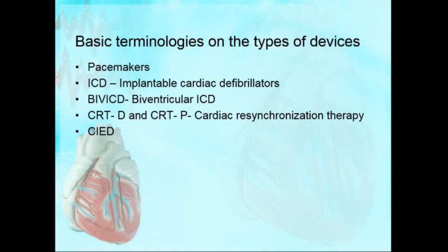Why should you know this? If you are taking care of a lot of transfer patients, many big institutions have moved on to this terminology. They don't use BiV. So where I was in EP fellowship, the Mayo Clinic Jacksonville, all the dictation notes would always say, patient has this, will qualify for CRTD. And if you've never heard of CRTD, you don't want to be caught off guard, this is CRT. So if you look at your MKSAP also, they moved on to use this terminology. And that is the accepted terminology for now over BiV. Patient needs cardiac resynchronization therapy. That's a much better terminology than BiV.